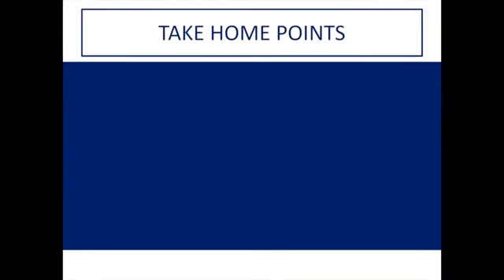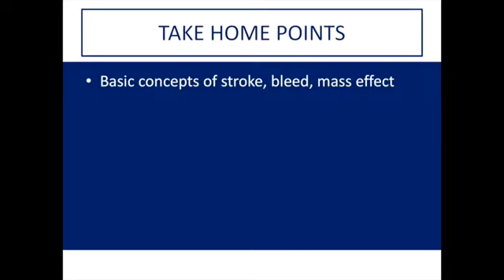Okay, so this is the end of the introductory CT head talk. After this slide, I will demonstrate a more complete approach to CT head on a more subtle case. You can listen to this if you wish, but the focus of this talk, which is a more conceptual approach for non-radiologists, is complete. So, take-home points. Know your basic concepts of stroke, bleed, and mass effect. They were introduced here, know them well, and always look for those three things on CT head.